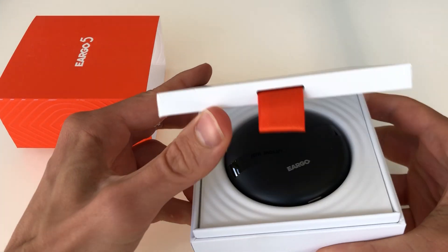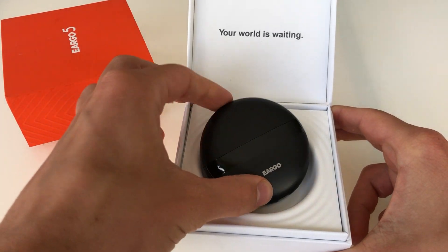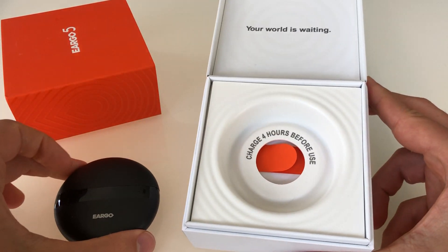They come in these two separate cases here. This is the rechargeable case, front and center. Charge four hours before use, it says.